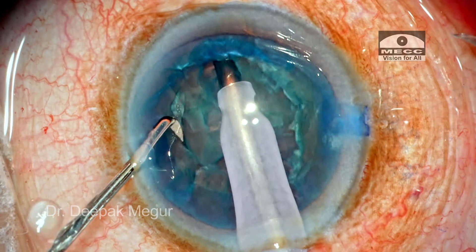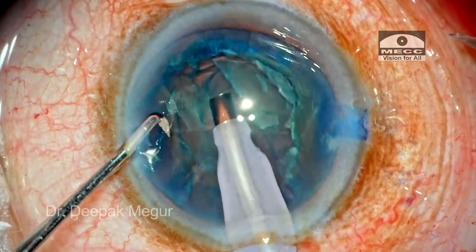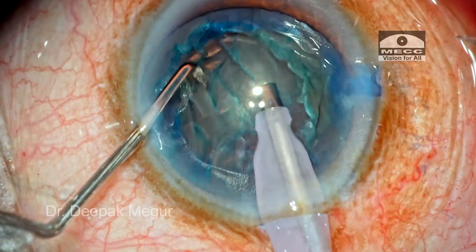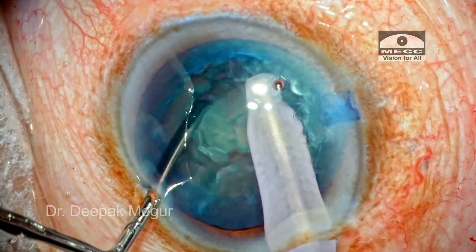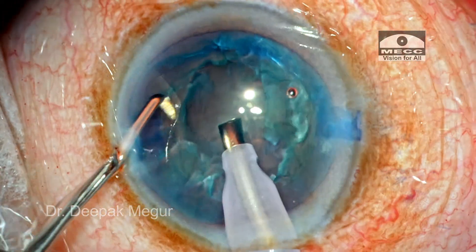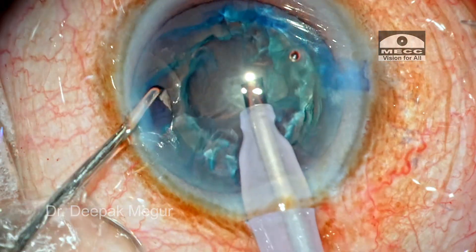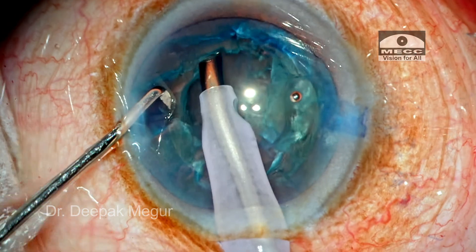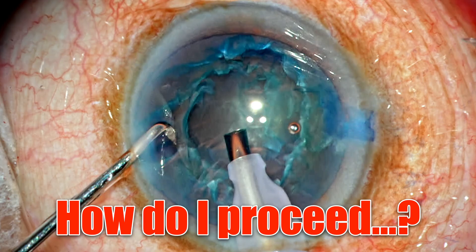At this stage, my plan is to divide the nucleus into just two pieces, remove each out of the bag, and then emulsify. The problem is when I attempt to divide, it divides but the nucleus is very crumbly — it is cheese-wiring. When I try to hold it, only part of the nucleus comes out. It is almost like I have created a bowl inside.